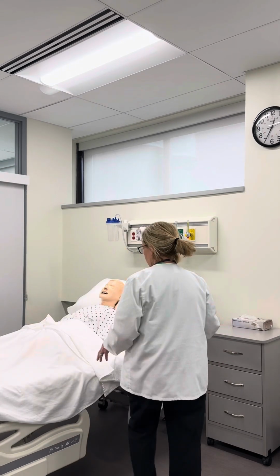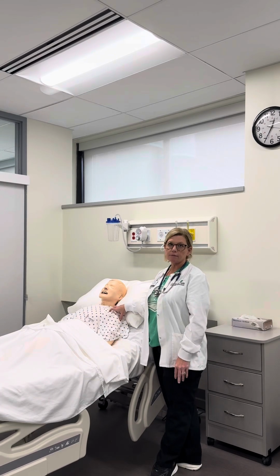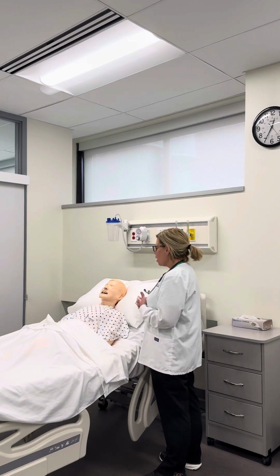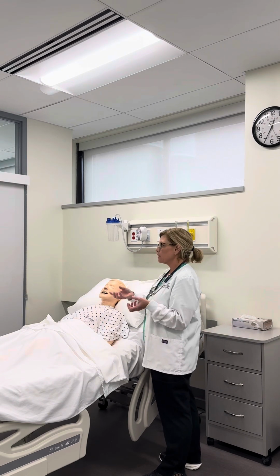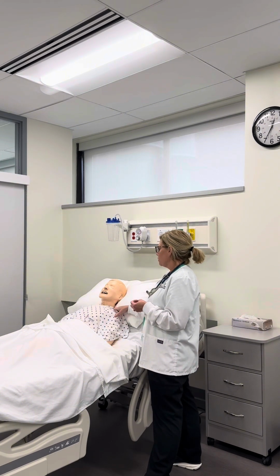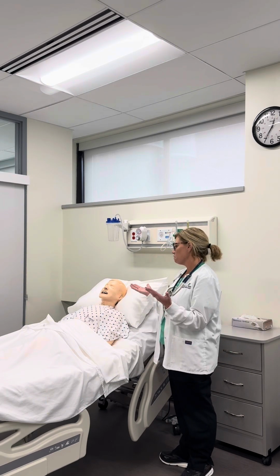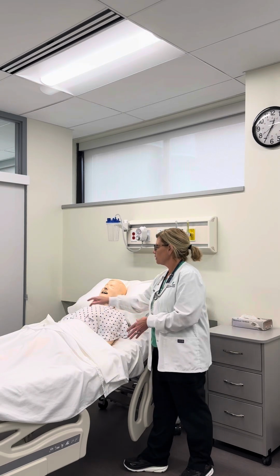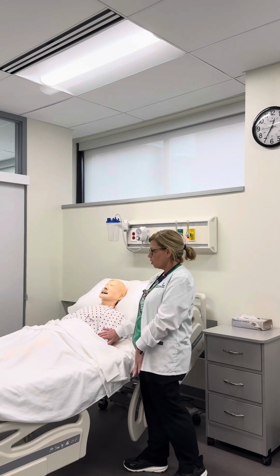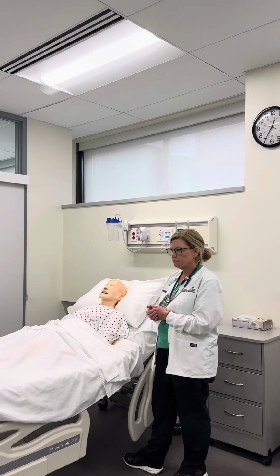So for my patient teaching, I can tell them that they need to keep the head of the bed elevated 30 to 45 degrees for at least 30 minutes to an hour. The reason for that is we don't want them to aspirate. So what we just gave them, we don't want that to happen. So I would tell them that and explain that to them, ask them if they have any questions. If they don't have any questions, then I just want to make sure that I leave them in a safe position. I have them covered back up. They've got their call light, and the bed rails. I can pull the bed rails up if they need to be up.